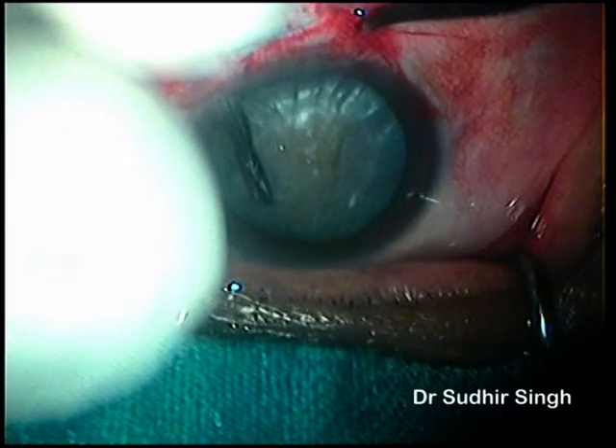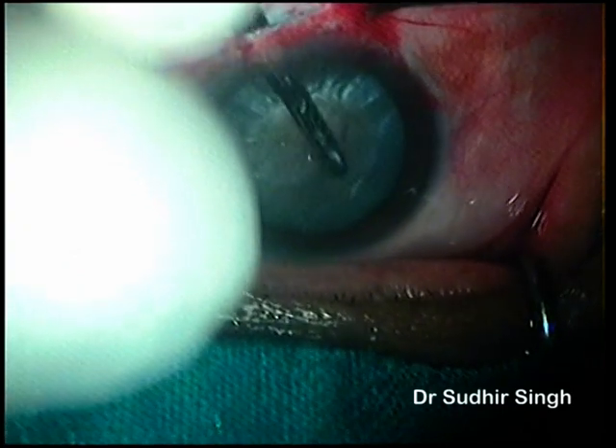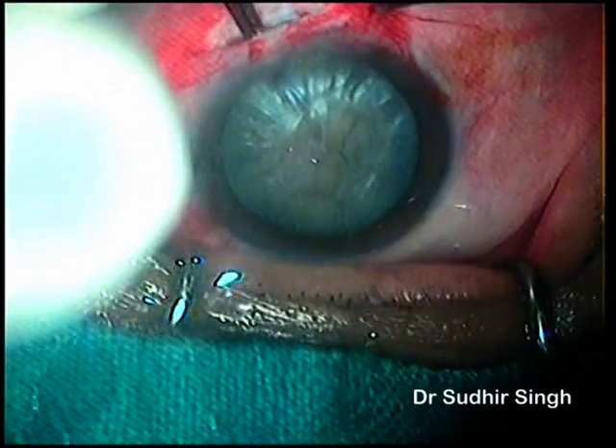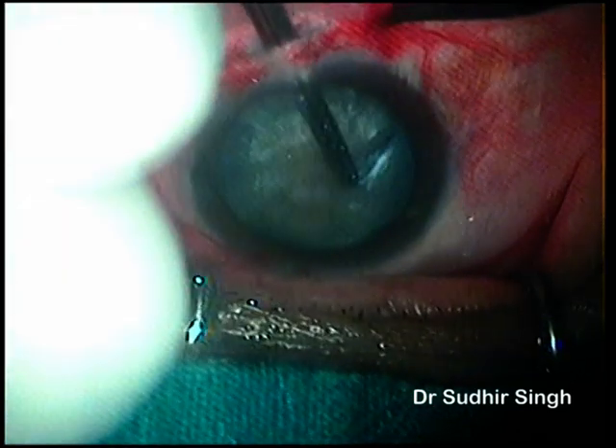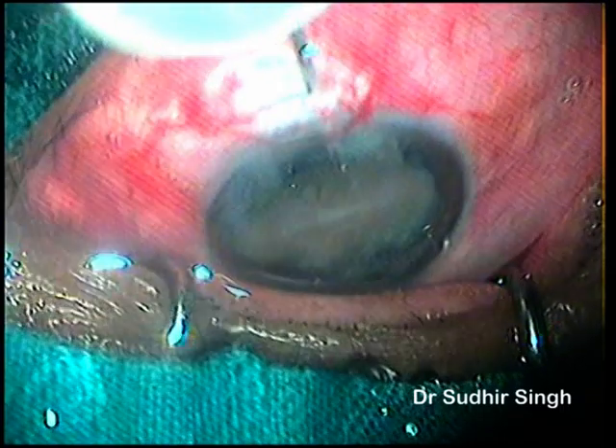In this case, the 3-stage capsular rhexis was successful, but the nucleus was found to be very hard and large, so we planned a 6 mm intratunnel phaco fracture using MSICS, as phacoemulsification might be risky in such cases.